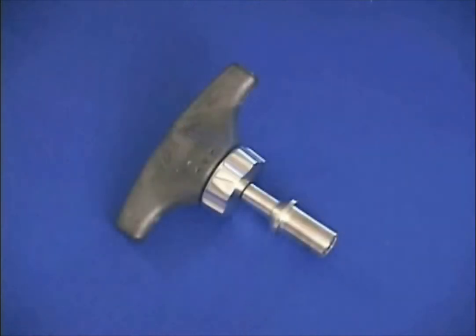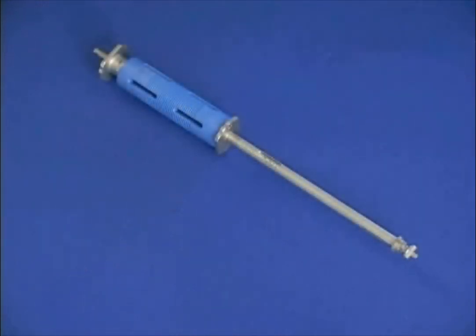The ratcheting T-handle is utilized with both the taps and the screwdrivers. It features a Hudson fitting for connection, and direction is controlled via the knob just below the handle. To accommodate individual technique, the system offers 3 different screwdrivers.